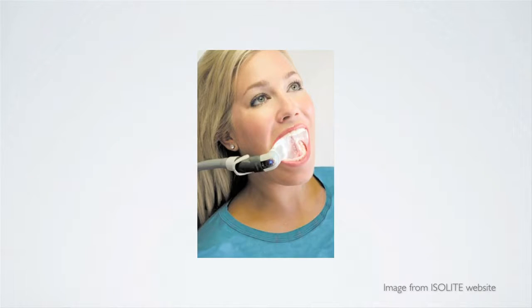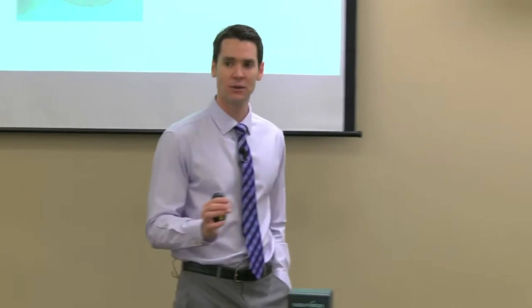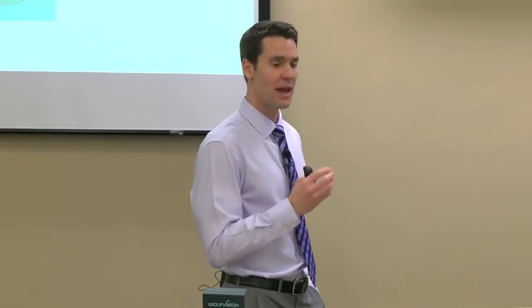Then we have something called the Isolite. I was taking this out of my presentations until the last one I gave in Vancouver when someone says, well, I use the Isolite, is that okay? So I threw it back in because people are using this for endodontic procedures. This is not enough to isolate the tooth and to keep an aseptic field. So if you're using it, it's a great device for operative dentistry, things like that, but not strictly for doing endo. If you want to put it in there with your rubber dam, great. I don't know how you're going to do it, but you certainly can try.